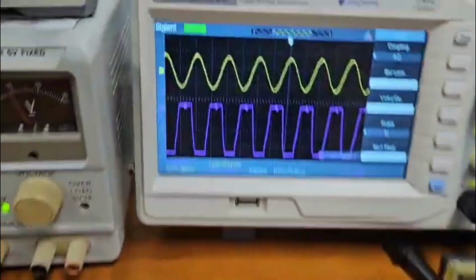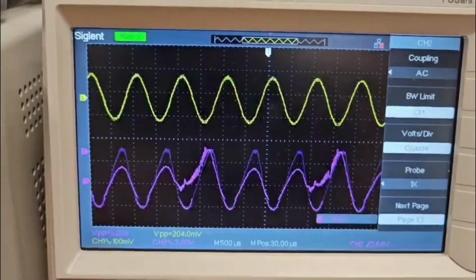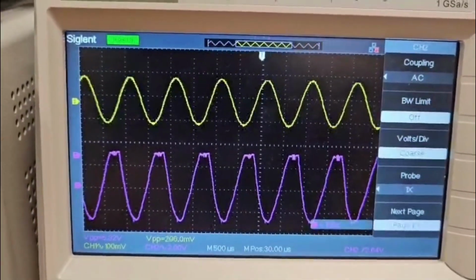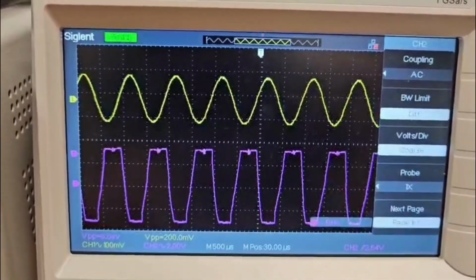And as you can see, if the gain is too low, the signal stays too weak to hear. But if it's too high, the output hits the voltage limit and clips, causing distortion or saturation.